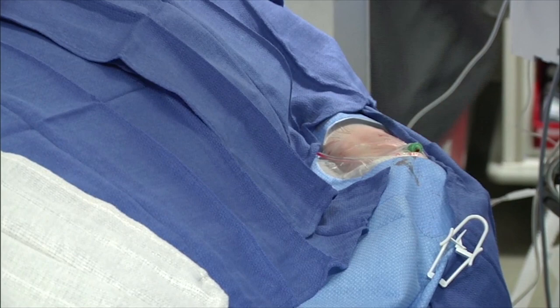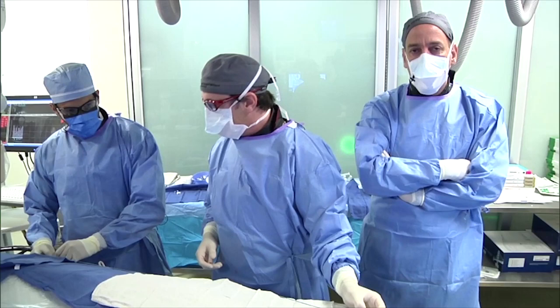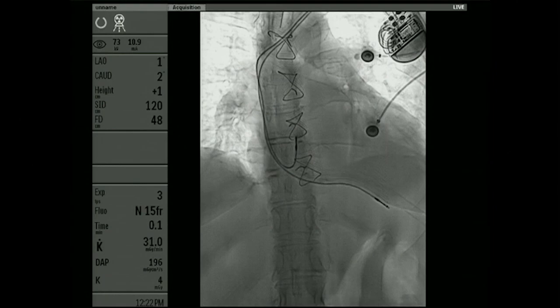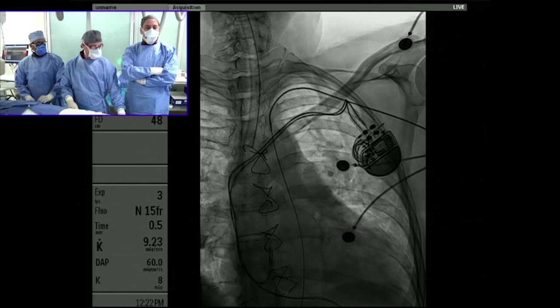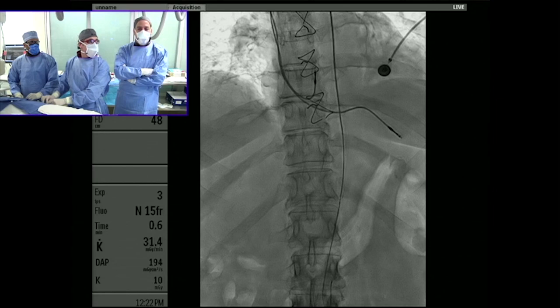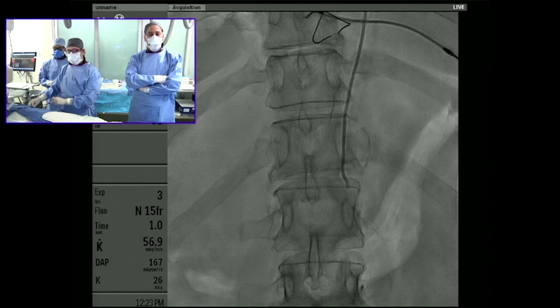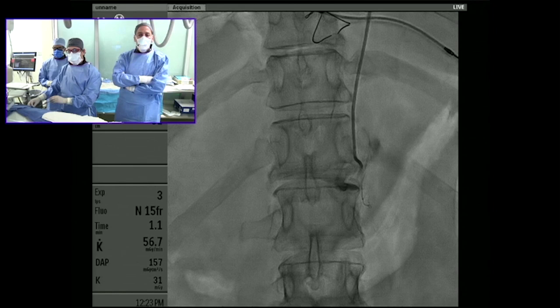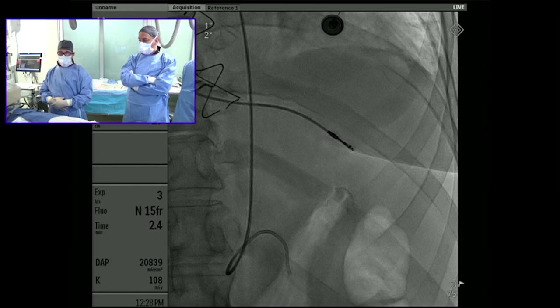We've given our standard cocktail: 3,000 units of heparin, 200 micrograms of nitroglycerin, and 2.5 milligrams of verapamil. To address the clinical indication — we work in a very busy liver transplant center in New York City. We see a number of patients with hepatocellular carcinoma being evaluated for liver transplant. Our surgical colleagues in the transplantation group prefer to have the splenic aneurysm treated prior to proceeding to liver transplantation.